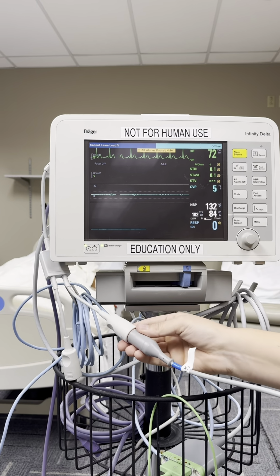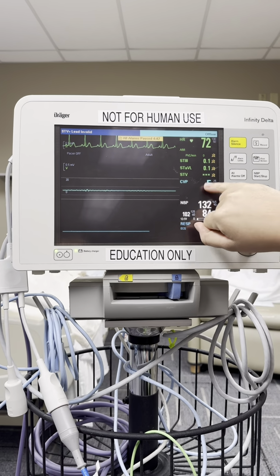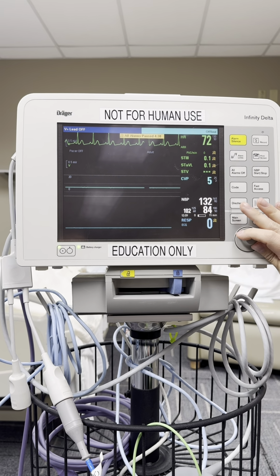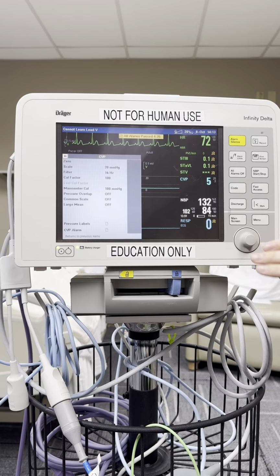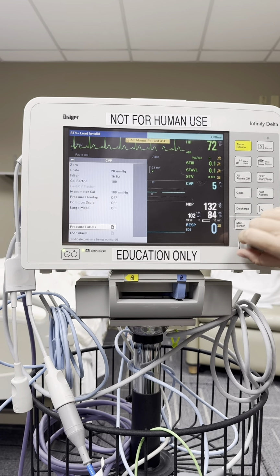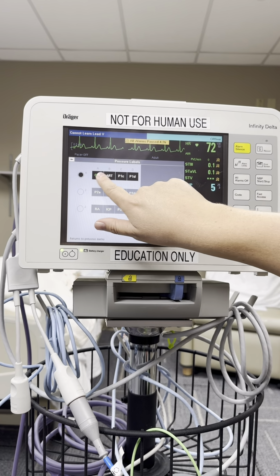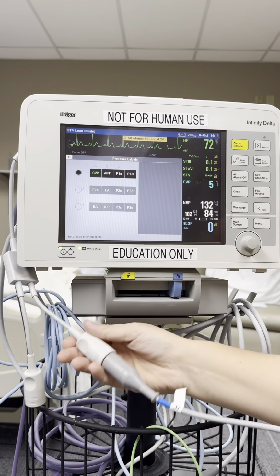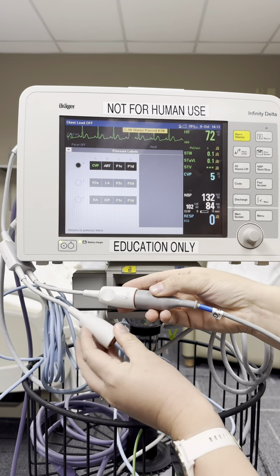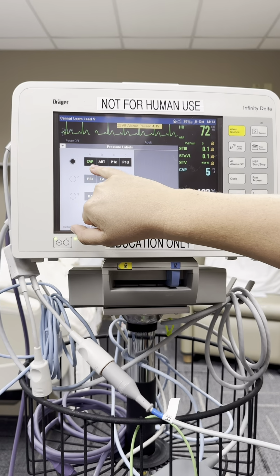If you have an arterial line and you're setting it up for the first time, as you can see, we've connected the wires down here, but on our monitor, it's reading CVP. In order to change, we need to change this label here. So we're going to scroll down and highlight the box, click it, and then scroll down and select pressure labels. When you select pressure labels, you have A, B, C, and D. If you look at our cord down here, we have an A cord and a B cord. Since we're plugged into the A cord, that's why we're green.